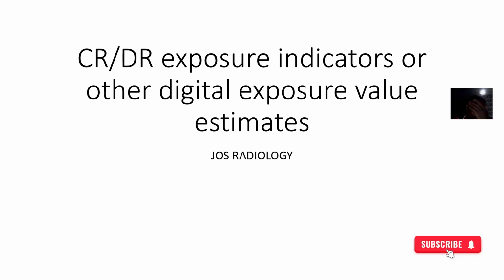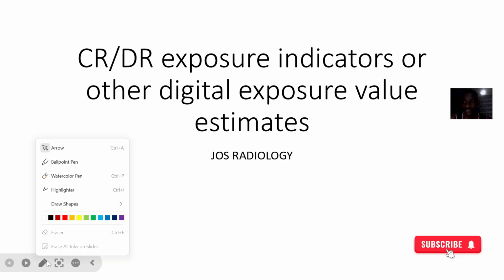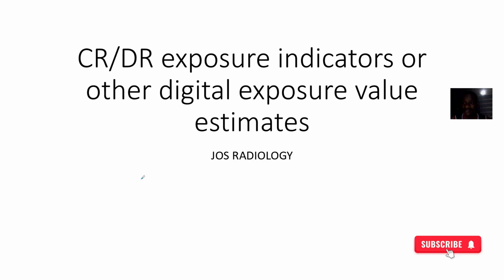Now we're going to look at some values that actually matter. Anytime you look at CR, they are talking about what? Computed radiography. Anytime you look at DR, they are looking at digital radiography. So we're trying to actually look at exposure indicators and other digital exposures.